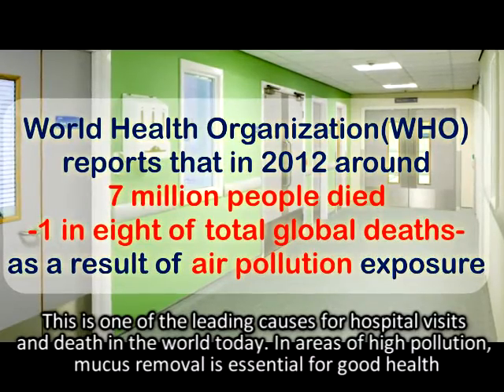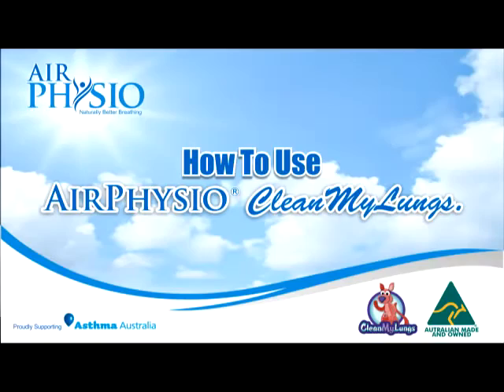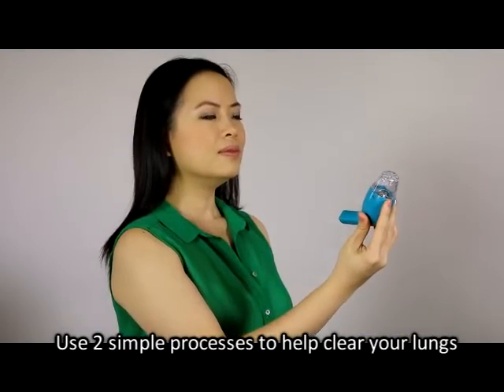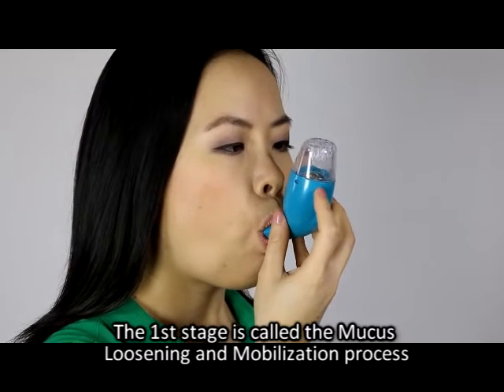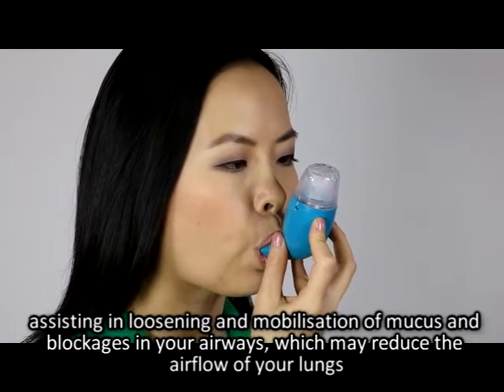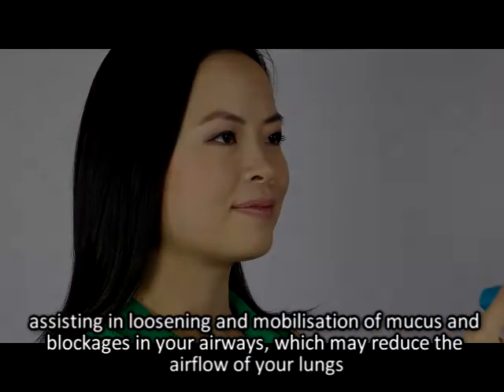This is one of the leading causes for hospital visits and death in the world today. In areas of high pollution, mucus removal is essential for good health. Air Physio Clean My Lungs uses two simple processes to help clear your lungs. The first stage is called the mucus loosening and mobilization process, assisting in loosening and mobilization of mucus and blockages in your airways which may reduce the airflow of your lungs.